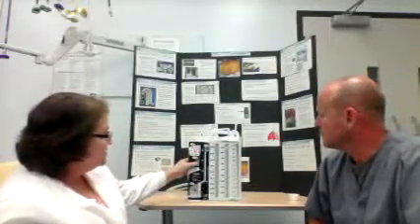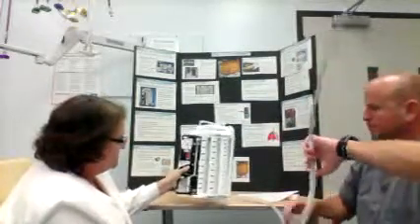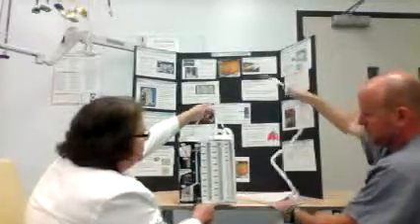Okay, alternate. Go ahead. Number 2, to maximize the chest tube drainage system efficiently, what should happen? A, the chest drainage system should always be below the patient's chest level, and the system should be upright. Like we talked to you when we showed you the system, there is a bottom piece that enables this system to sit flat on any surface, most especially the floor, or you also have your hangers that go onto the bed.